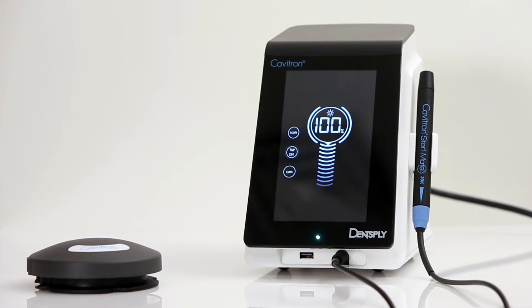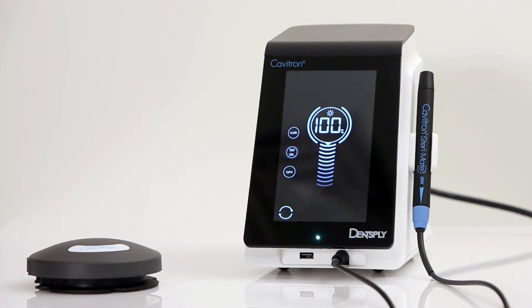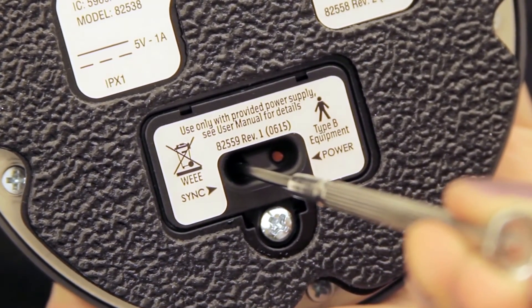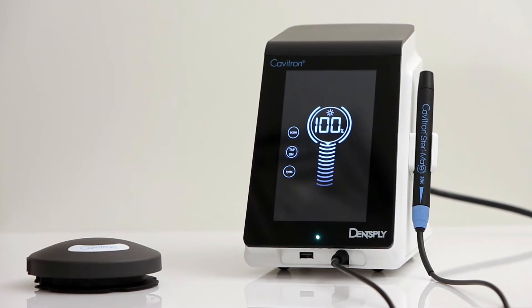Press the sync icon on the settings screen, followed by pressing the red sync button on the bottom of the foot pedal and hold for at least 3 seconds. Synchronizing is complete once the sync icon has stopped rotating and a sound indication occurs.